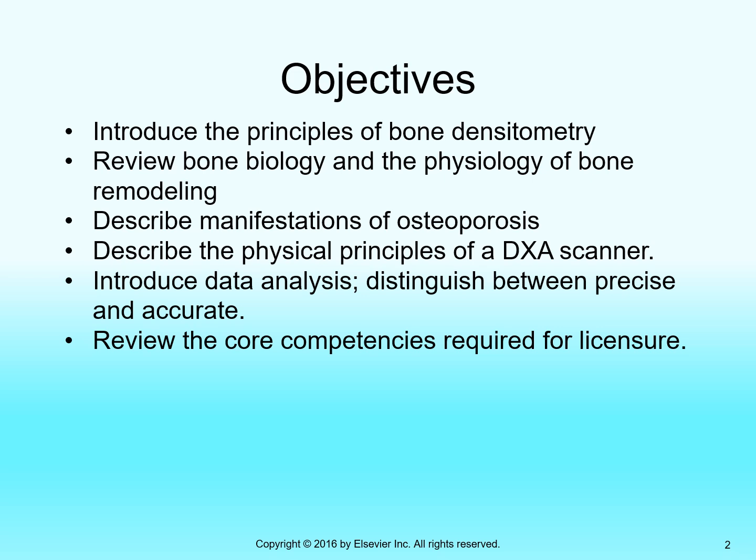What's the average bone density for that group, and then what is your bone density? So you can track the progression of an individual, but you can also map that individual and their individual scores against what we know is the collective data set, that is the average for human beings. And so those are the ways we measure bone density in the bone densitometry exam.